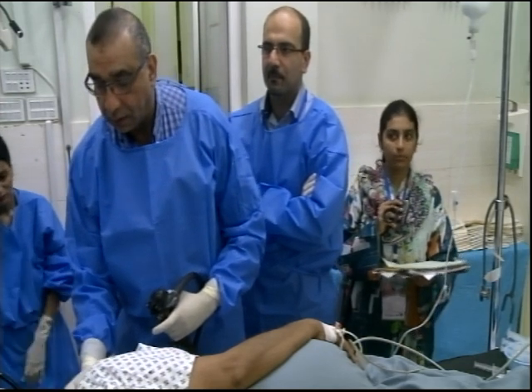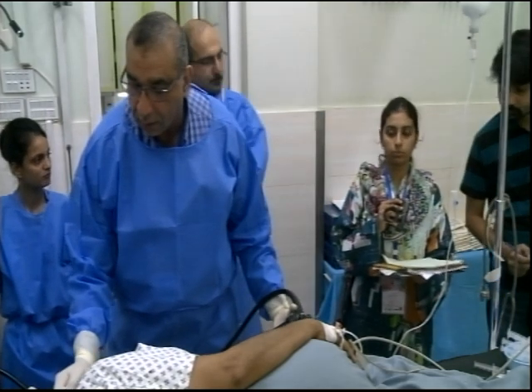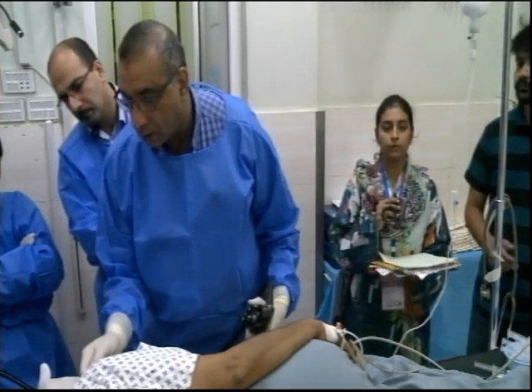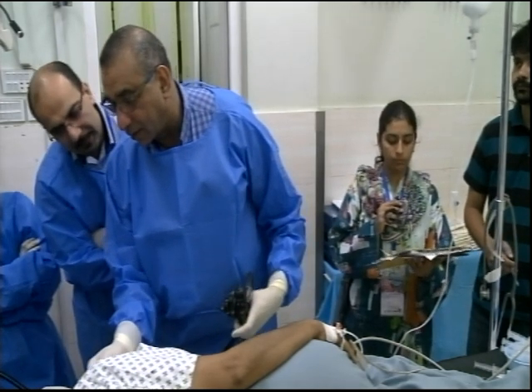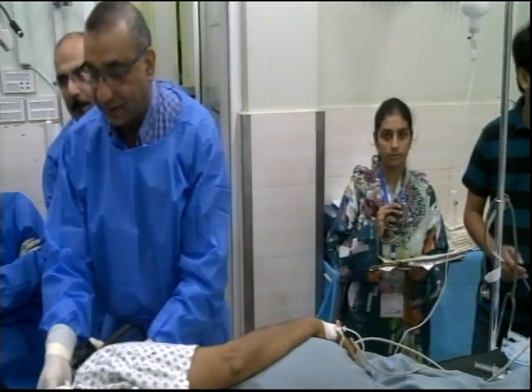The first case that we have for today is of a 48-year-old female who presented to us with a history of epigastric pain and weight loss for 1 year and obstructive jaundice, for which ERCP was done 2 months back. Her CT scan shows a lesion of 2.6 by 2.3 centimeters infiltrating the head of pancreas and uncinate process.